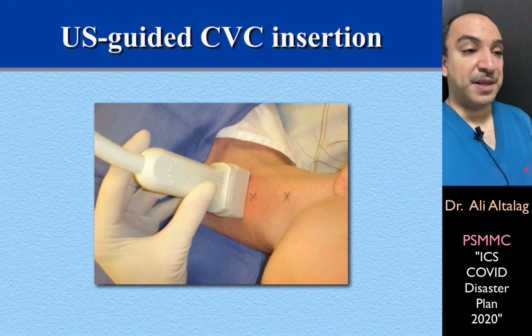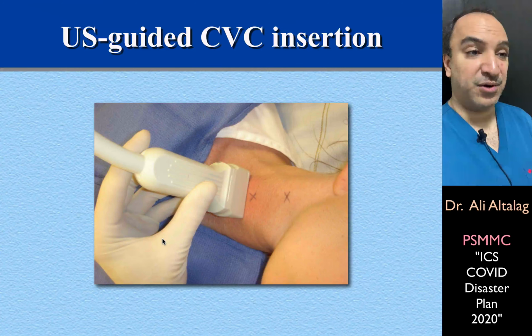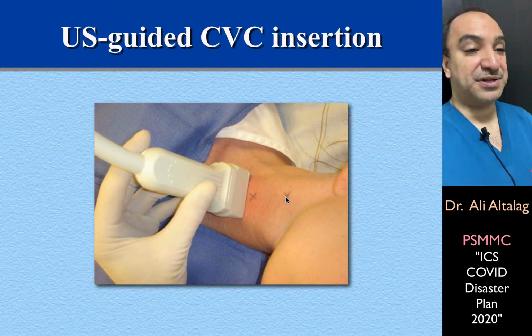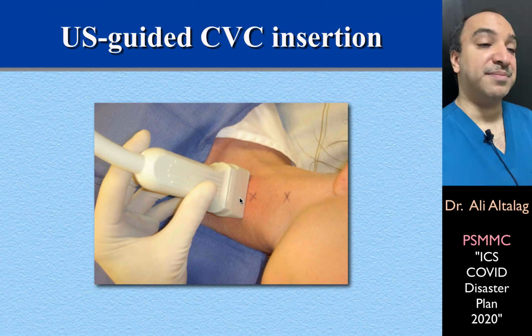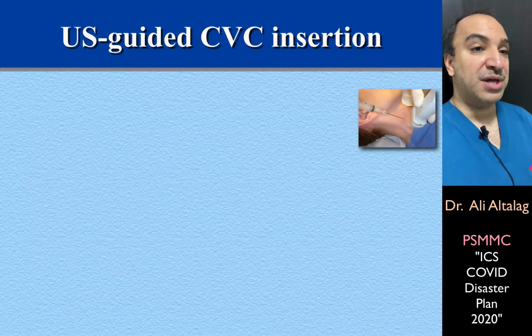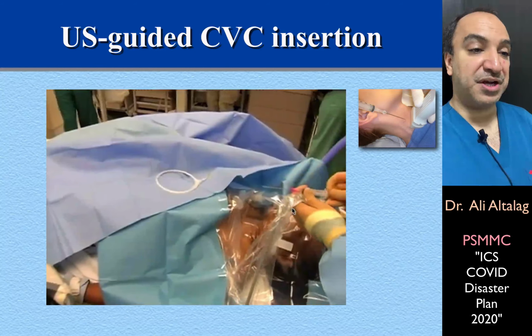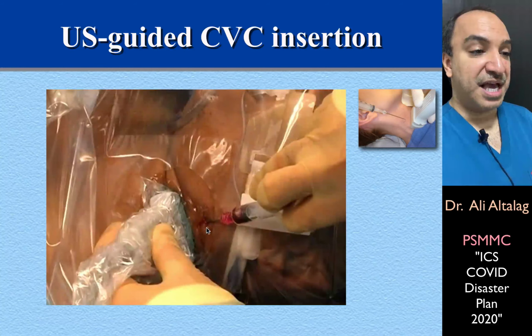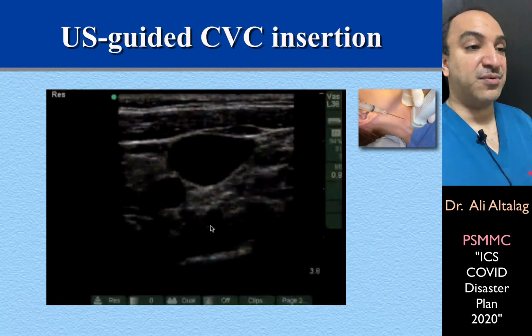Now, ultrasound-guided central venous catheter insertion can be either static, whereby we map the vein and then throw the ultrasound transducer away and do a blind or semi-blind insertion, or dynamic, where we can use again the transverse or longitudinal approach live. Now, this is how we actually do it. For the live method we use a sterile sleeve, and we clean the patient very well, and after we get the vein, we pass the guide wire.